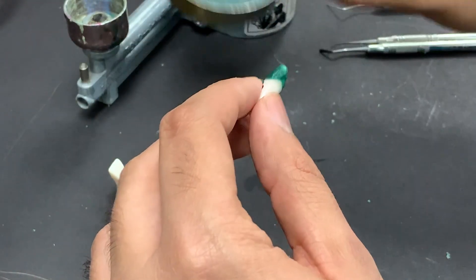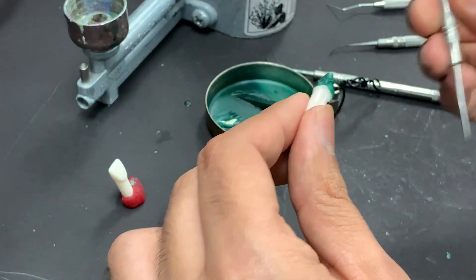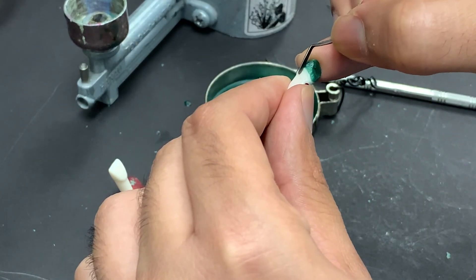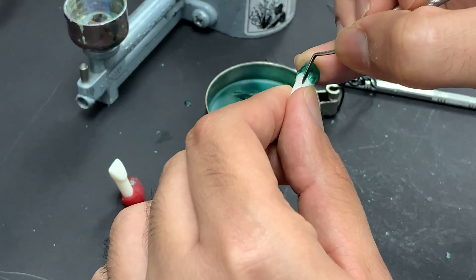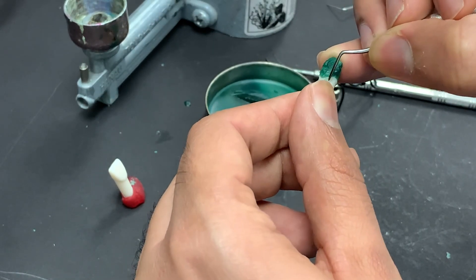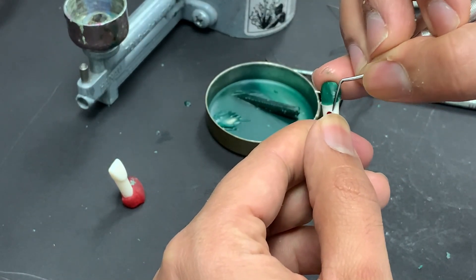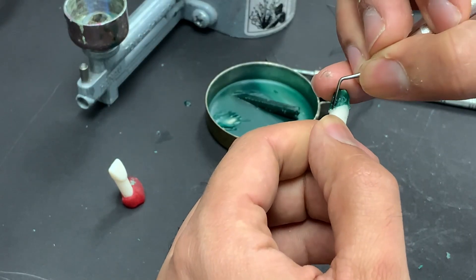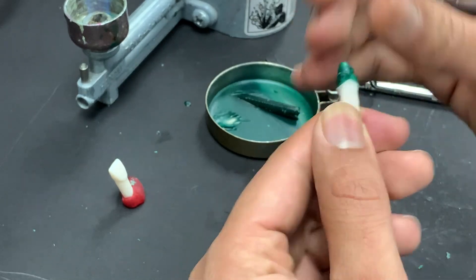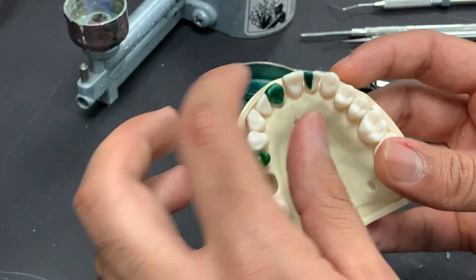After adding the initial coping layer, use a carver or the UTSA 37 instrument — half on the tooth and half on the wax — and go around the margin to clean it up. You want a clean margin with no voids, nothing supra or sub-marginal, flowing smoothly from the plastic tooth to the wax. After the initial coping layer, screw it in tightly to get the right contact.